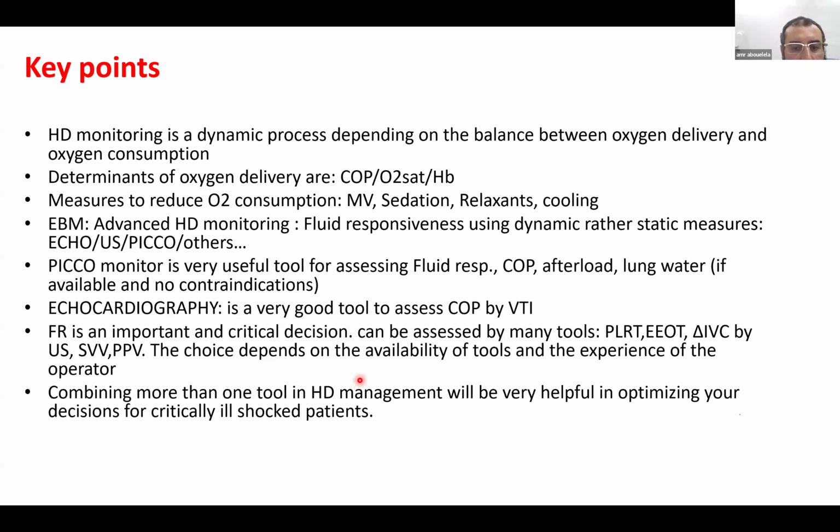Echocardiography is also a very useful tool and a good tool to measure the VTI, estimate the stroke volume, and derive the cardiac output from this. Fluid responsiveness is an important and critical decision, and can be assessed by many tools like the passive leg raising test, expiratory occlusion, the variation in the IVC by ultrasound, stroke volume variation, and pulse pressure variation.